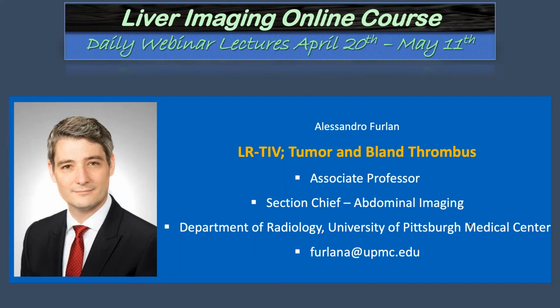Is the bland thrombus similar in imaging to the necrotic hypoenhancing tumor thrombus? That's a very good question. In other words, if I can rephrase it, can a necrotic tumor thrombus mimic a bland thrombus? Yes.